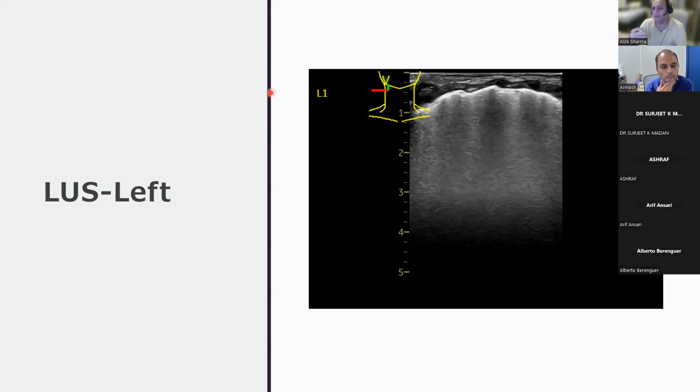And this kind of arbitrary definition of saying that BPD should be defined at 28 days and that chronic lung disease is defined, I think is going to change very much with the evolution of lung ultrasound. I think this ability, and Almedina will speak to you about this in a lot of detail, and how we probably need better definitions of how we think lungs are evolving in terms of lung disease for the extremely preterm baby. But I completely accept what you're saying.